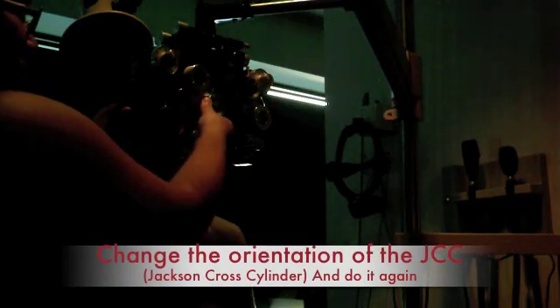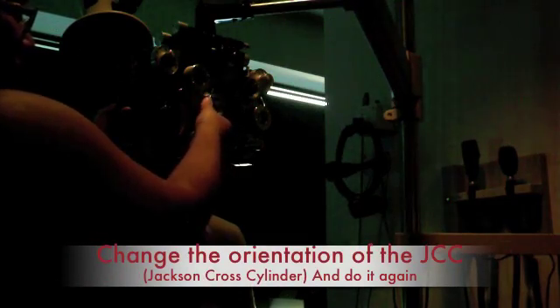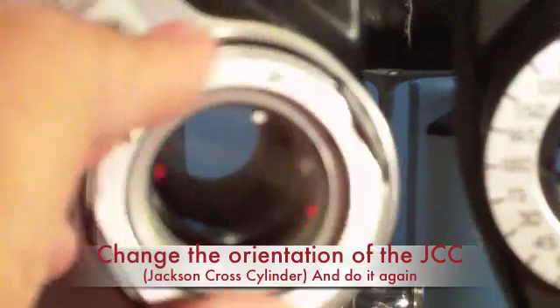Once we have refined the axis to our liking and to the patient's liking, we refine the power — or how much cylinder we're going to prescribe. I'm orienting the JCC here so that I can determine the power. If the patient chooses the red, they need more cylinder, which can be adjusted with this other dial, and you can see the numbers change in that little window.